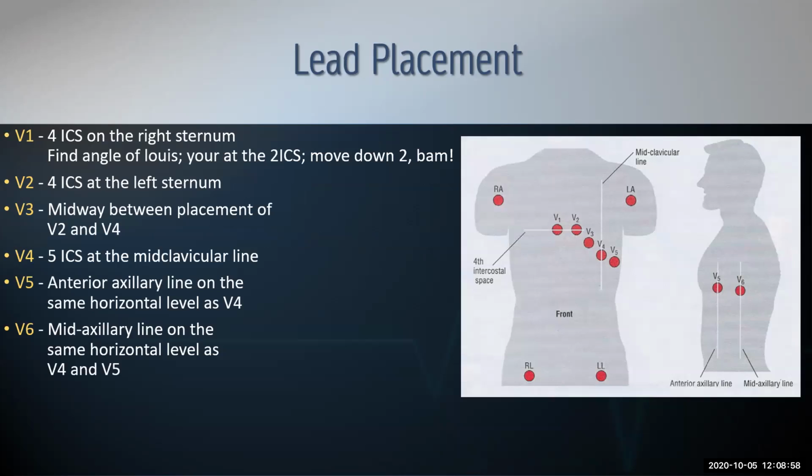For the placement, this is where I was telling you that it's important to know from an anatomical perspective, because it's going to affect our ability to know where infarctions or ischemia might be happening. And then we can relay that to the cardiologist if we're calling them overnight, for example. And then we can even see, based on maybe their blood pressure, if it's low and we're thinking this is a right ventricular infarction, does it make sense based on what we're seeing on V1 through 2 versus V4 through 5. This is something you should commit to memory.